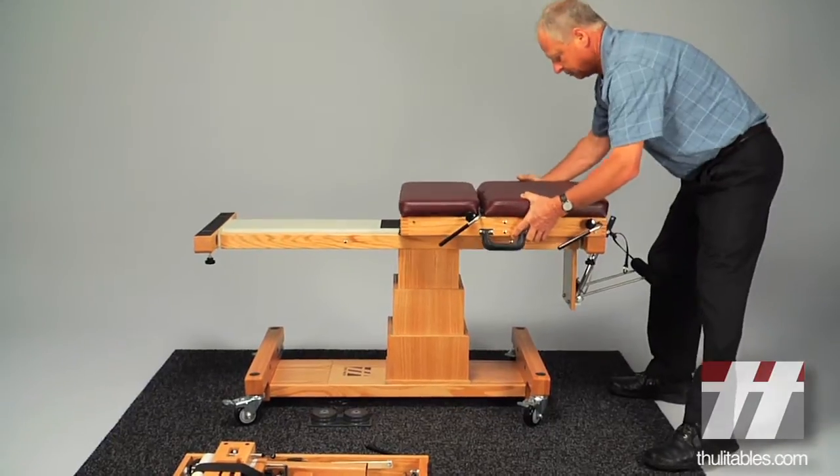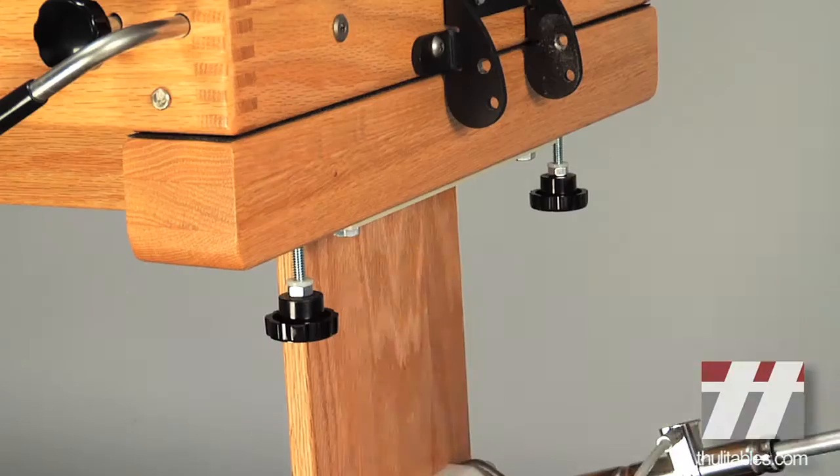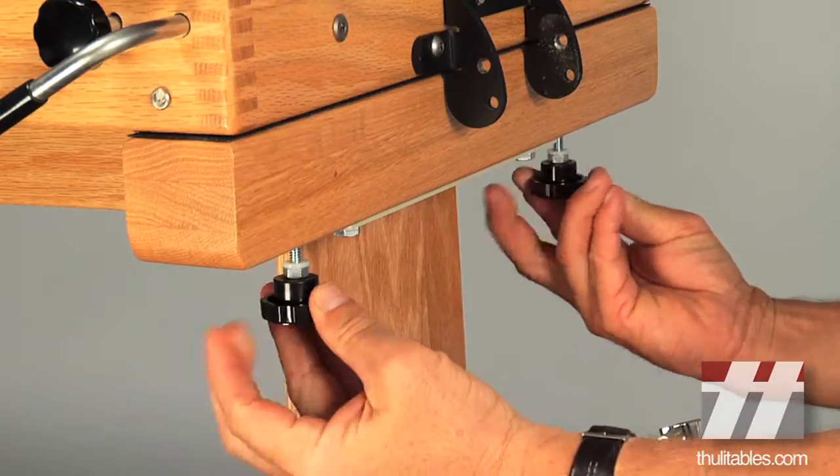Place the front half of the Tour portable table onto the conversion base and engage the knobs underneath into the threaded inserts located on the underside of the table.